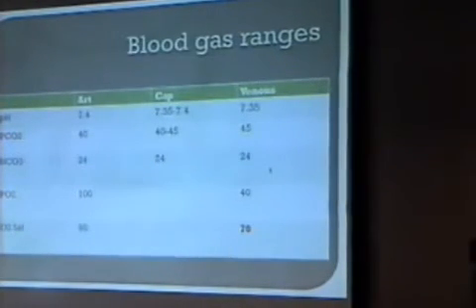Okay, just to mention, arterial, capillary, and venous. So in arterial side, you have pH of 7.4. We said everything plus minus 0.05. Okay, but pick one number because it makes it easier for calculation. Venous has higher CO2, right? Because the venous side you have more CO2. So the higher CO2 will get your pH down a little bit. So 5 will get it to 7.36. So close enough, so 7.35.